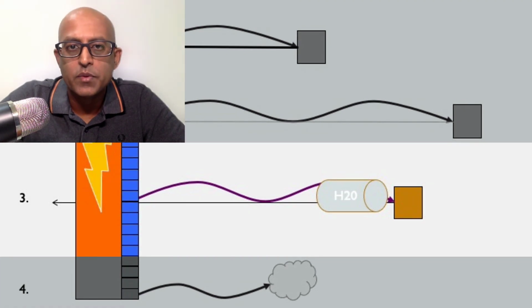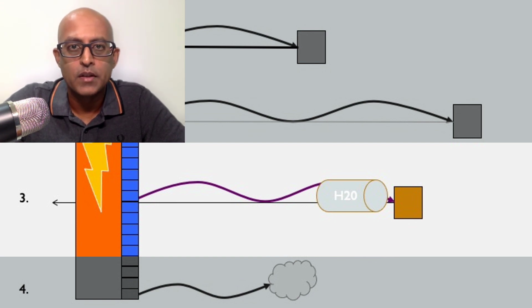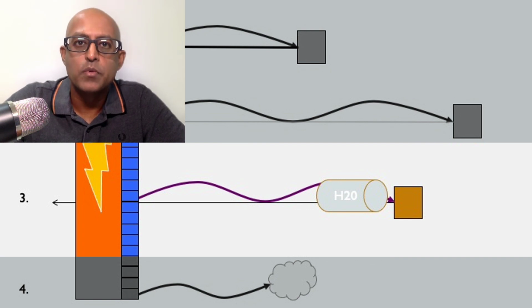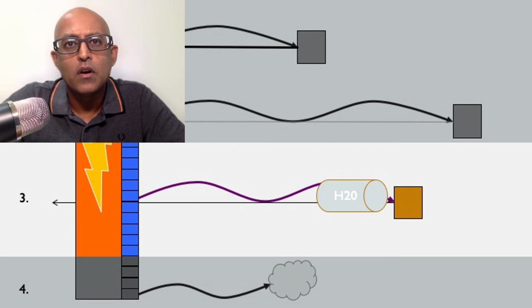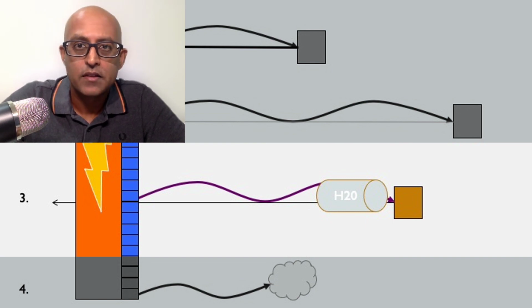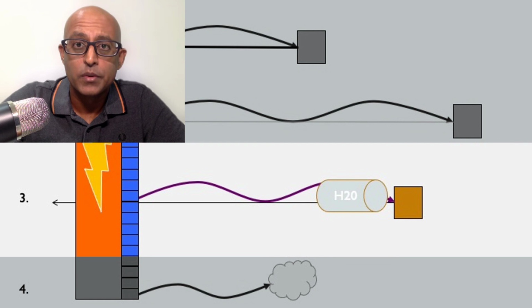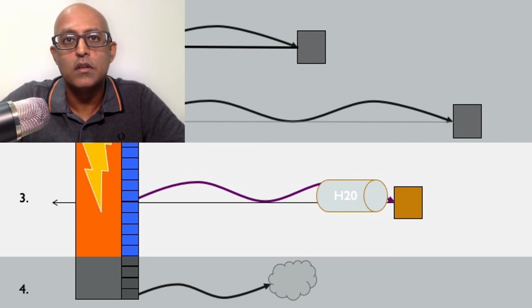An important phenomenon with ultrasound is when it meets a fluid interface. Fluid transmits ultrasound waves really well, and this is why we use ultrasound gel for coupling between the transducer and the subject. Fluid on an ultrasound image will appear black, and that's because the sound waves pass all the way through. But what you'll often find is that the distal end of that fluid structure will appear brighter, and that's because as the sound waves meet that interface, there's a sudden massive reflection of the sound waves back, and as a consequence it will appear brighter, and this is called acoustic enhancement.